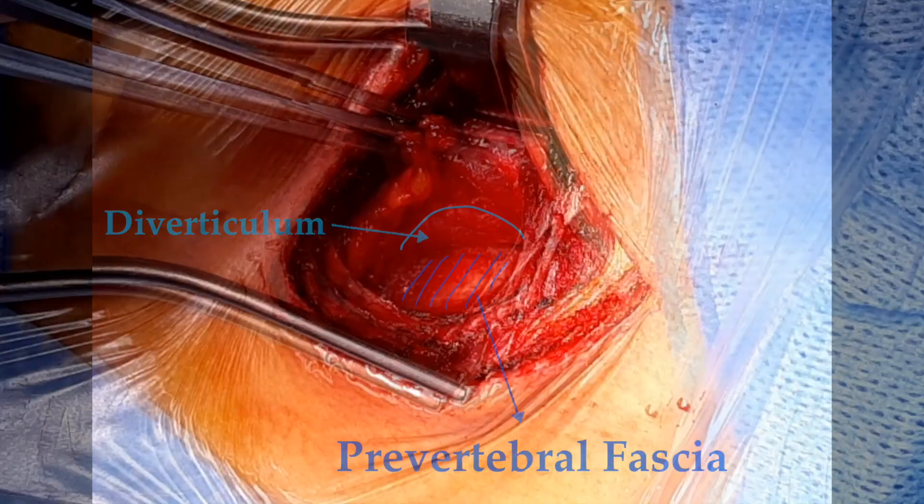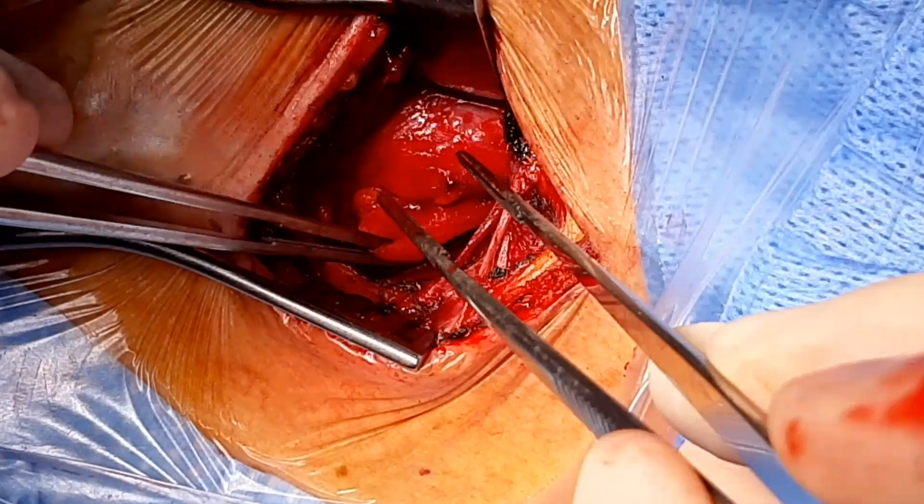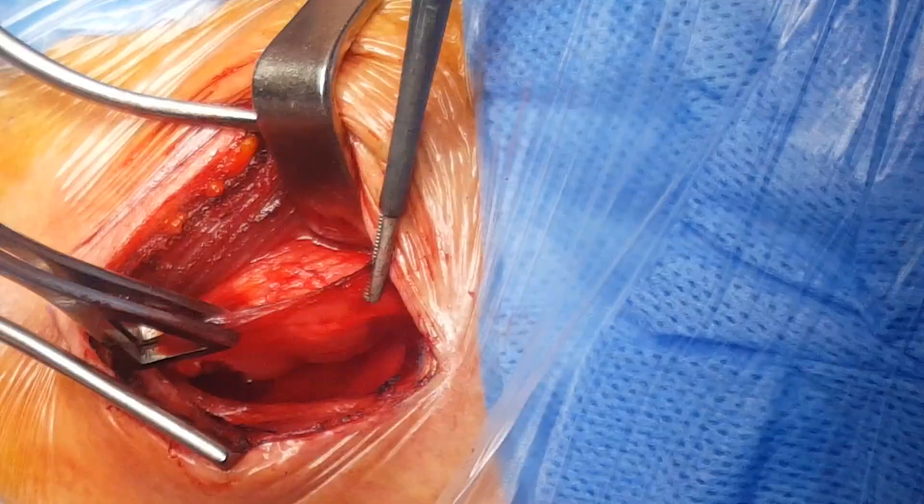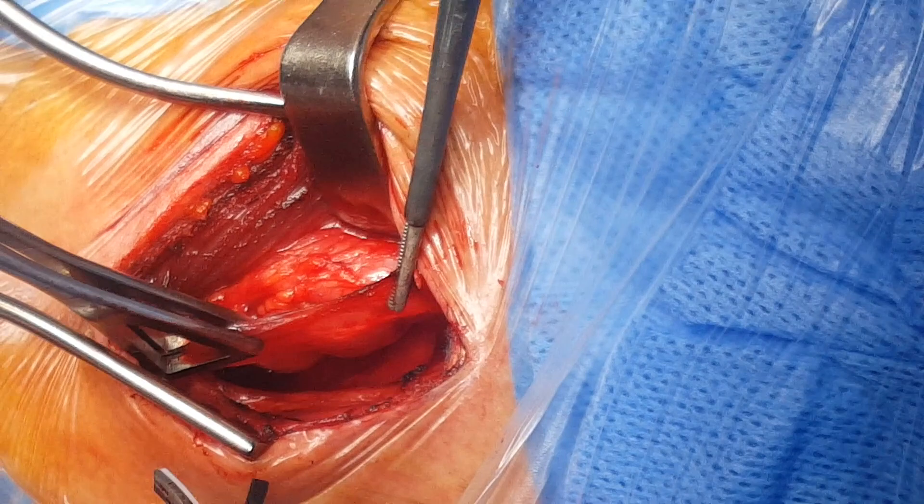Dissection is required to free the diverticulum from the surrounding tissues and adhesions and to reach the neck of the diverticulum. This surrounding tissue is then divided with the ultrasonic scalpel.